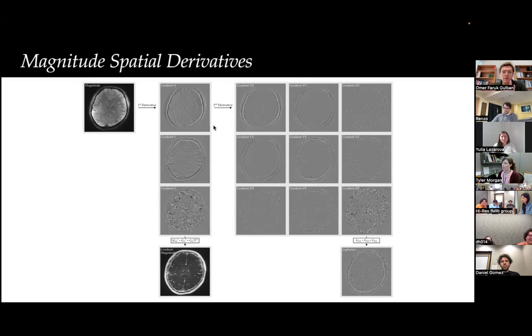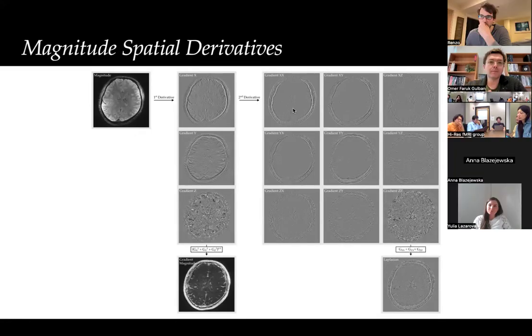So, okay, now I'm moving towards the Laplacian to explain what it is in this image processing context. To arrive at the Laplacian, you need to compute the second spatial derivative as well, which means that you need to compute the rate of change among x, y, z on the gradients themselves. Which basically turns the vector field into a matrix field or a tensor field. This means that each voxel is now represented by 9 values eventually. So this is a tensor.